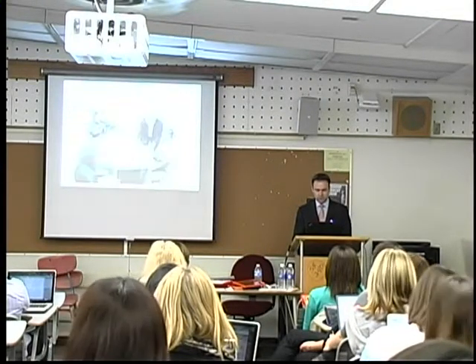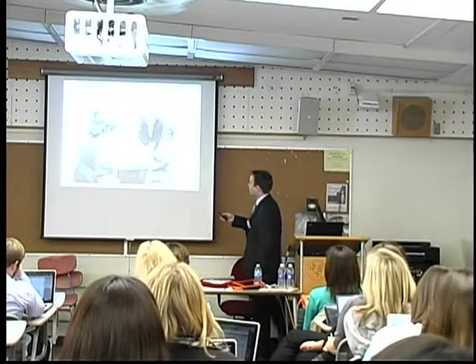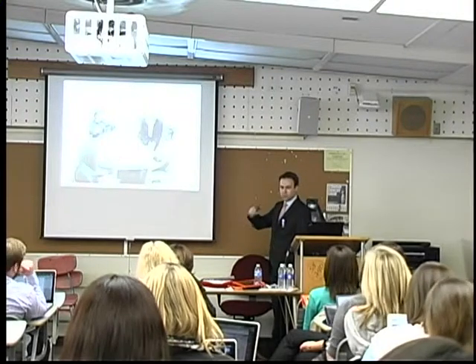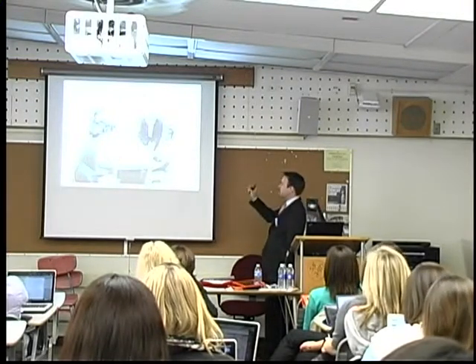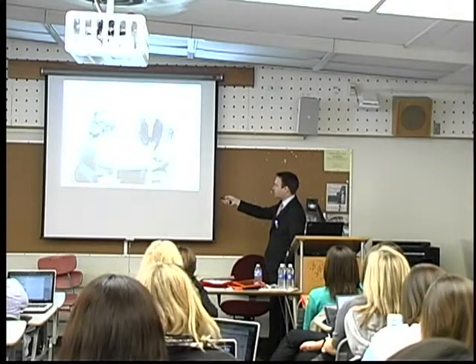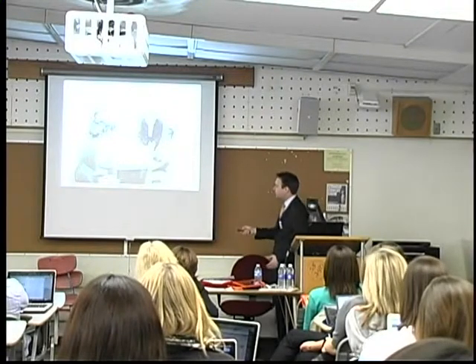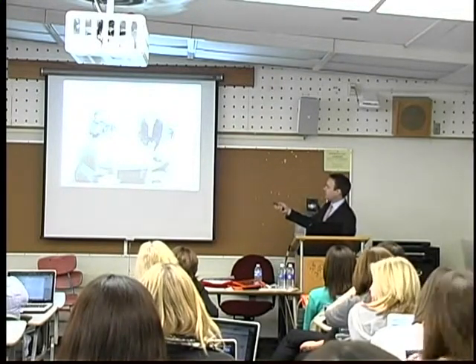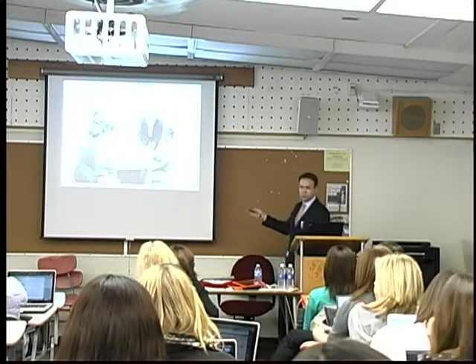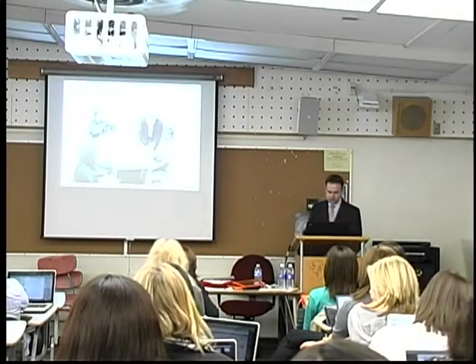All right, this goes on and on. I'm now fast forwarding to the end of phase 5. He learned to combine an I want symbol. He learned to discriminate between different symbols on the Prox Talker. We then taught him to do an I want symbol first plus desired item. And now he's at one of those later phases, where she is asking, what do you want? And he's supposed to do his own little sentence on the device.